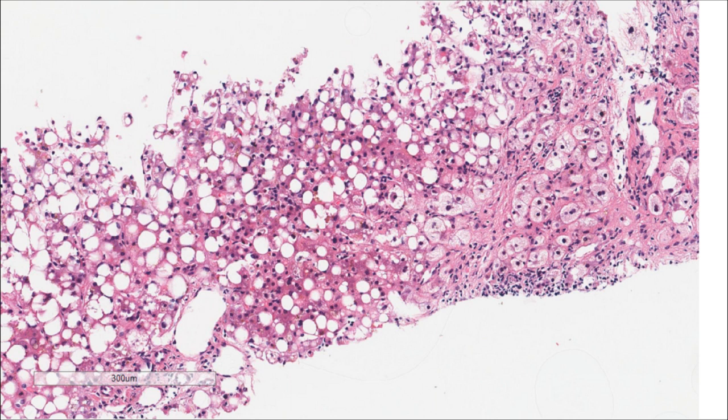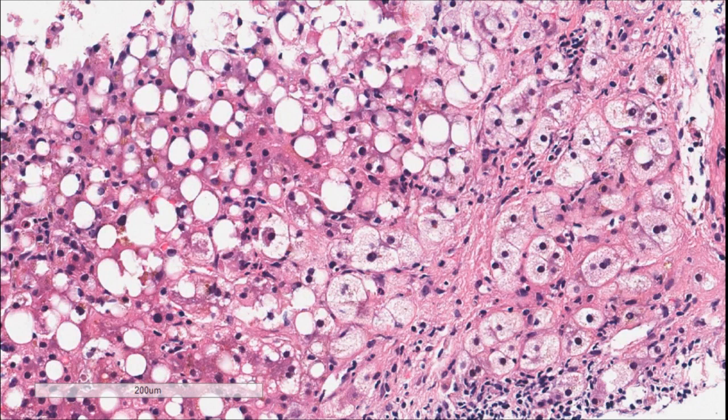As one looks across the liver biopsy to the right, one can see that the textural quality of the hepatocytes starts to change. You can see that there is a little bit more granularity to that cytoplasm. This shows you that those hepatocytes are undergoing ballooning degeneration, as shown here on higher power. So we have pretty severe steatosis because most of the hepatocytes have fat, as shown by the vacuoles in the hepatocytes, and we have a significant amount of ballooning degeneration. So we have severe steatosis with moderate to severe steatohepatitis, as shown by the ballooning degeneration. And the arrows now show you these hepatocytes with ballooning type degeneration.